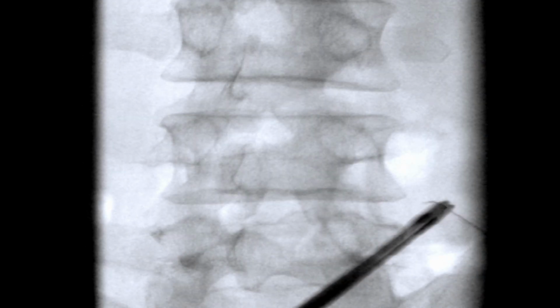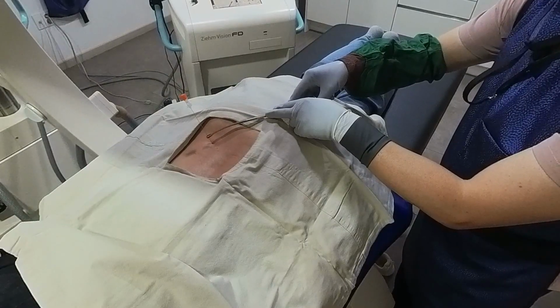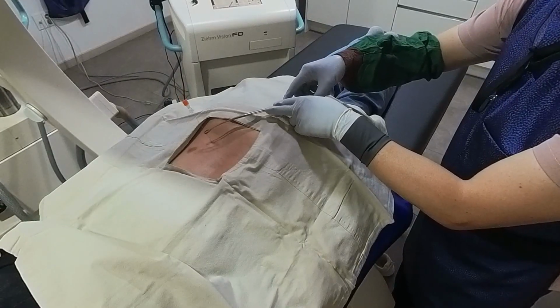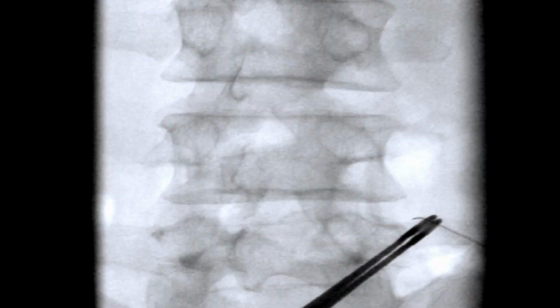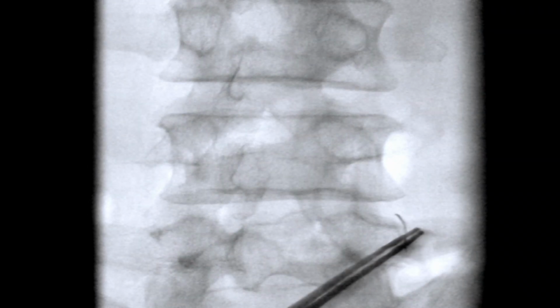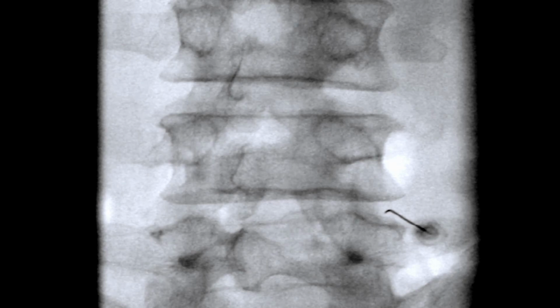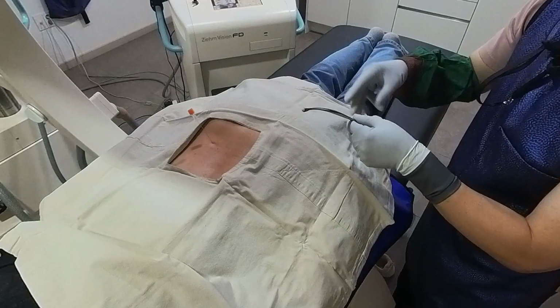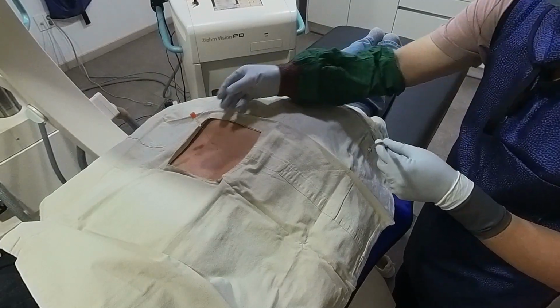I initially approach with the needle held by long forceps. These placenta forceps give me more precise control and protect my hand from radiation as I navigate the needle through deep fascia and muscle layers. Once the needle path stabilizes, I hold it with my bare hand for better tactile feedback. You'll watch alternating between C-arm and needle views throughout the procedure to follow each step closely.